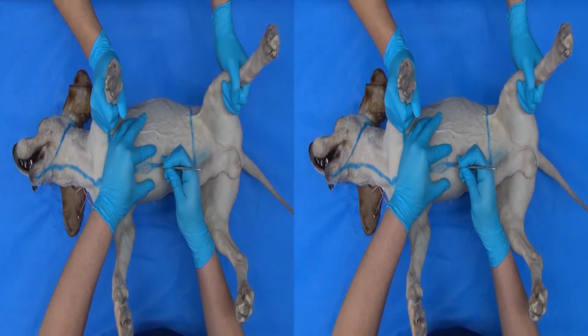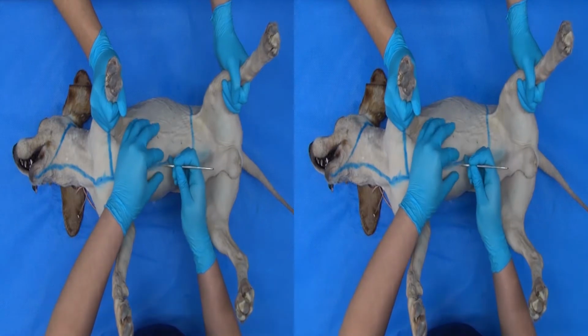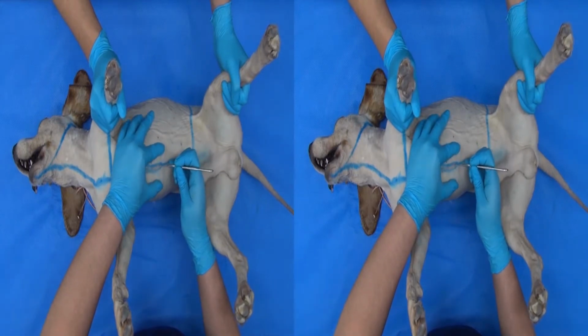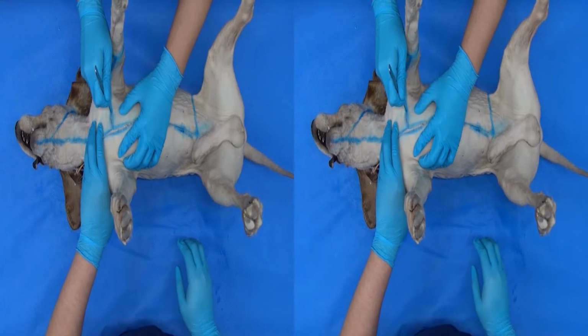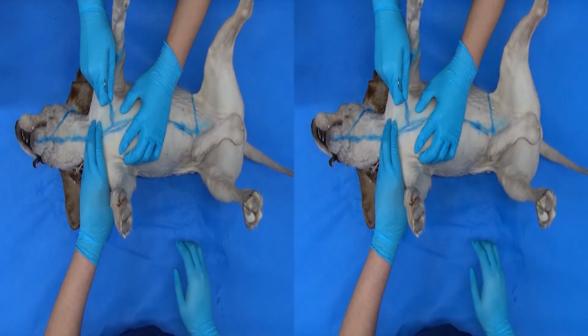In this video, all the hairs are shaved to make a clear image, but it is not mandatory during practice. You only need to remove the hair if you think it will interfere with the incision.